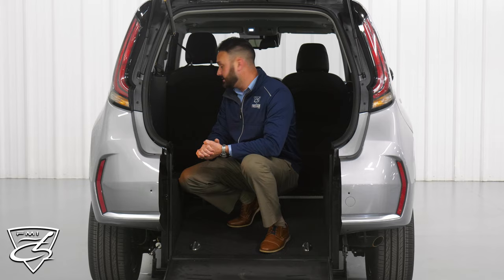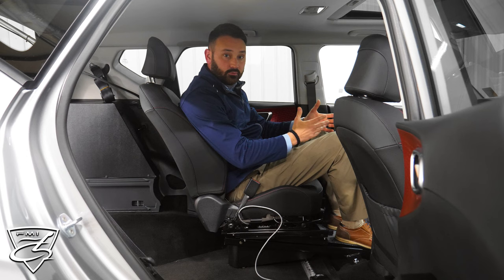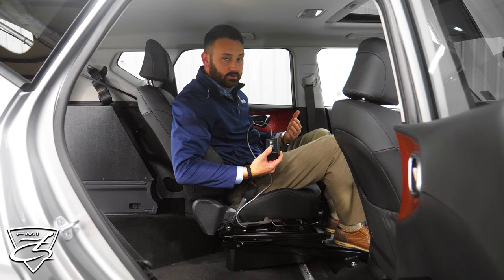Next, we'll show you this power transfer seat. This power transfer seat maneuvers from the driver position all the way back to allow for an easy transfer. The wheelchair occupant will be able to maneuver in and become parallel to the seat, transfer over, and then glide back forward. This is ideal for somebody who is looking to gain independence and be a driver. A great thing about our conversion on this seat is the remote that's attached — by the simple press of a button, you can glide forward and backward to get yourself adjusted properly.